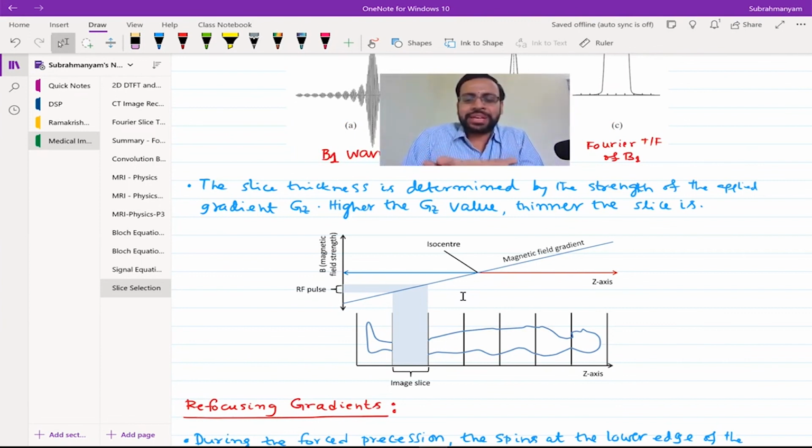And then how do you get the FID signal or T2 relaxation signal? You take the projections on the XY plane, correct? Yes, sir. So since each of them is rotating at a different speed, the moment you are projecting it, each would be at a different XY location when you take the projections. So all of them cancel each other out. That's right.